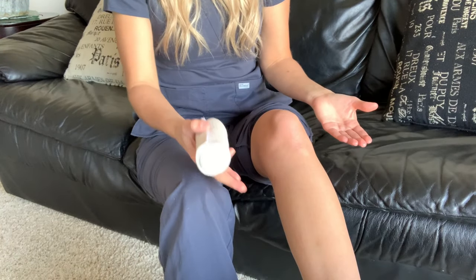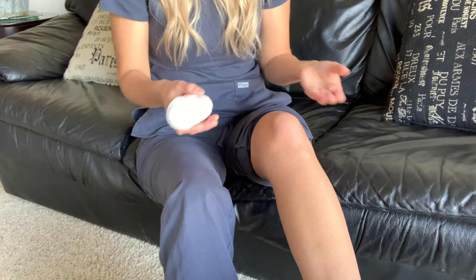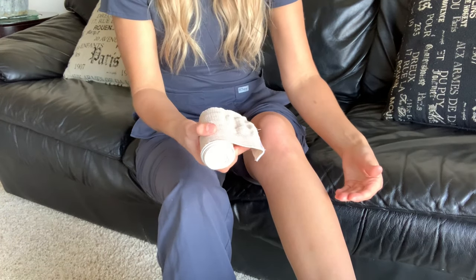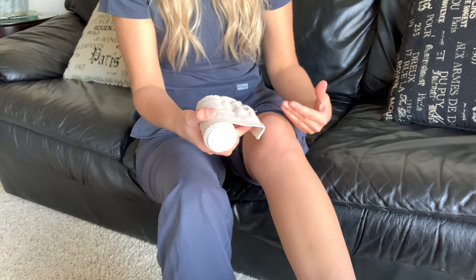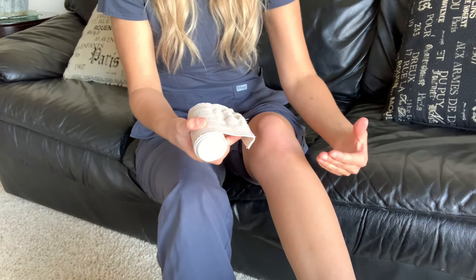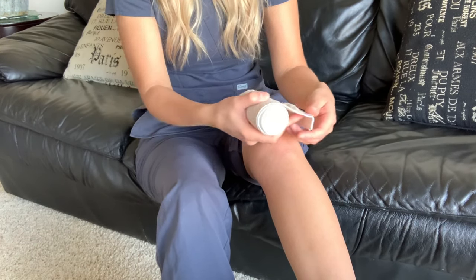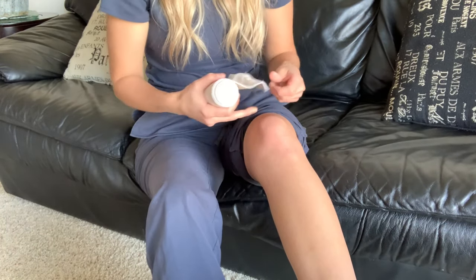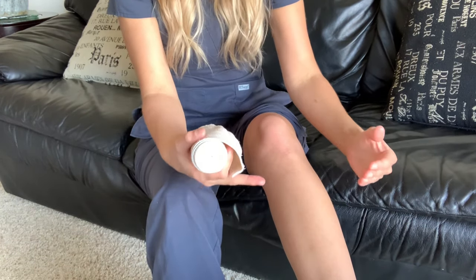The knee should be fairly relaxed with a slight bend so you know it's being applied in a comfortable position. You're going to start below the knee and you always want to apply the bandage from below the knee and work your way up, because if there is any swelling, that will help push fluid back up into circulation towards the heart. If you start up higher and work your way down, any swelling will be pushed down into the calf, so you don't want to do that.